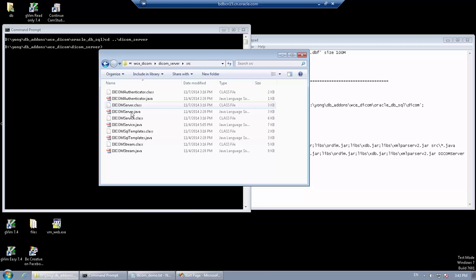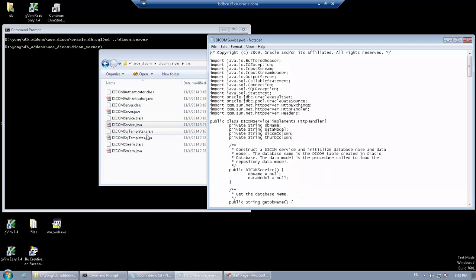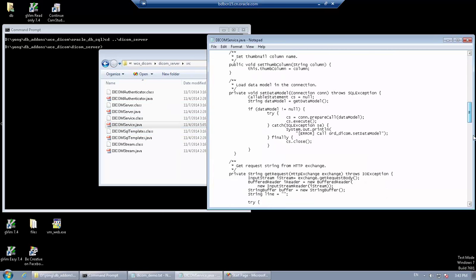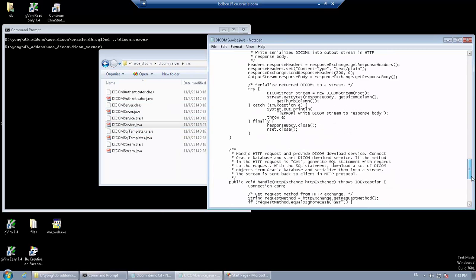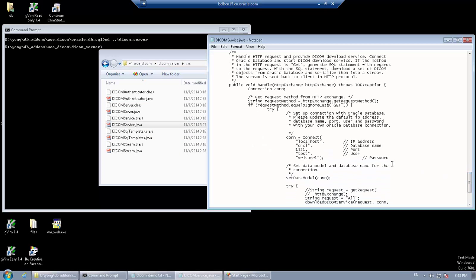Before compiling the application server, you may need to edit the DICOMService.java file and make sure the Oracle database connection information is correct.